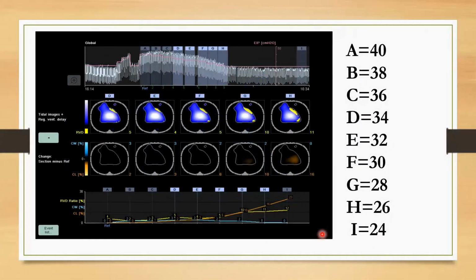We look up here, you notice that there's no PEEP, there's no green PEEP line. This is on APRV. So we use the customized analysis. We're looking at CW in blue for compliance win. Compliance loss will appear in orange. We're using very high pressures, and we would never really do this unless it was guided by tomography, but there was significant distension. So we have to push back against that pleural pressure.